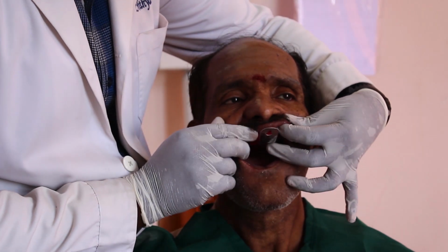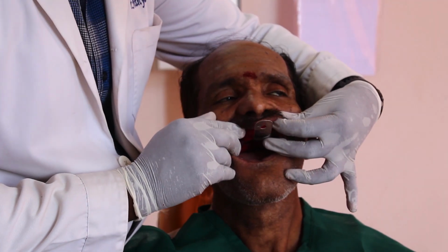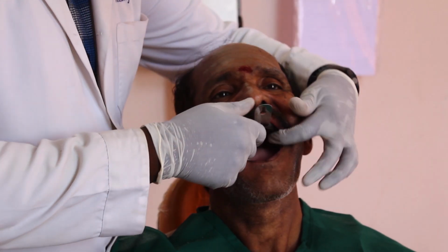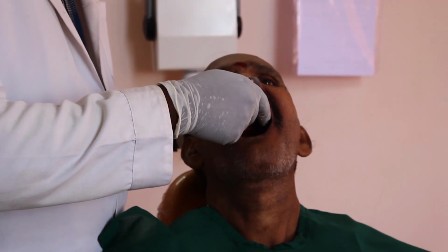Just inspect the impression material whether it has become hard or is still soft. Now I could see it has become hard. So I am going to remove the impression from the patient's mouth. Make sure the patient's head is supported while removing it.